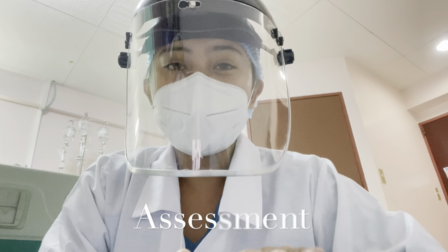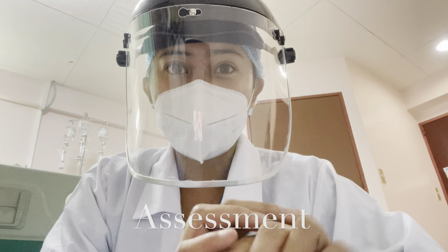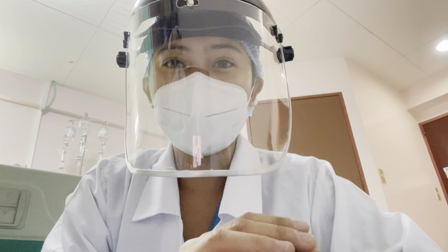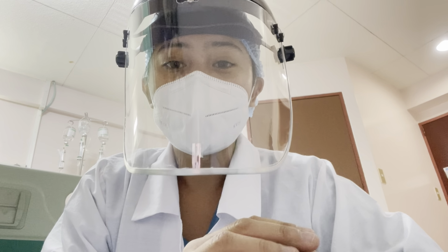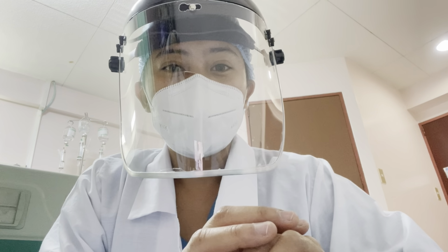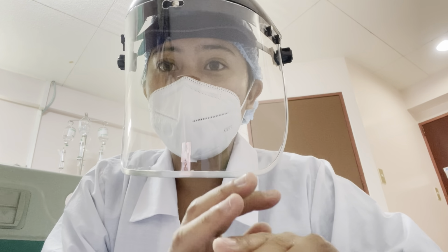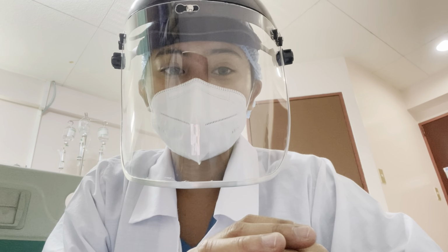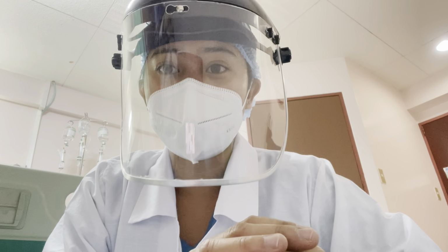For the assessment, the expected behaviors are the following. Number one, we need to check or review the doctor's orders systematically, including the solution that we will be instilling in the affected eye to receive irrigation, because this is used for accuracy of the amount of the solution for an effective procedure. Second, we also have to assess for the reason for eye irrigation.